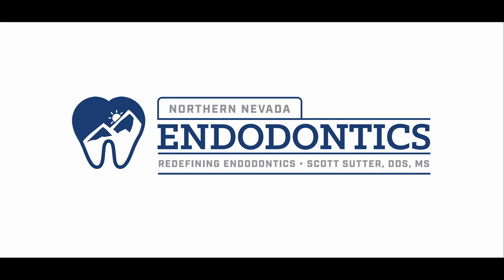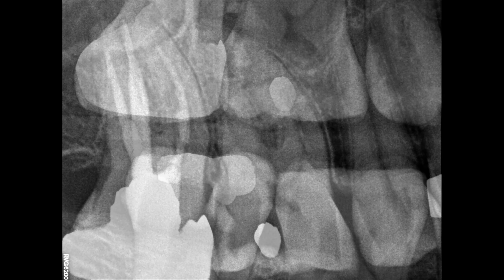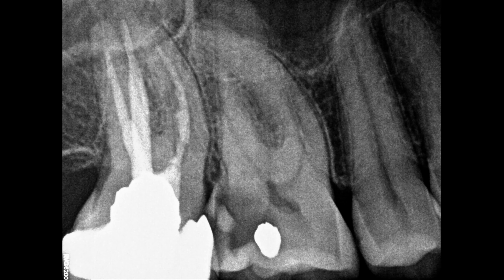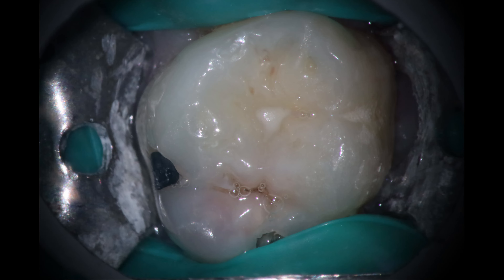Hello everyone and welcome back. Got a fun curvy one for you today. I've been waiting for a good one to record so you can see how I address these curvy shaped canals. You can see the deep caries there on the distal. A lot of this is because of the overhang from the crown. You can see a decent sized curve on those mesials.